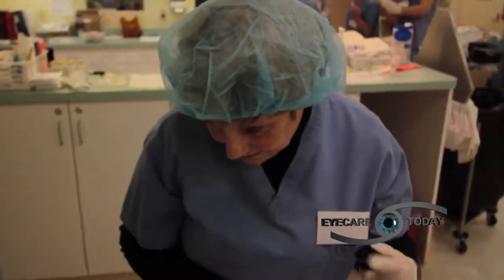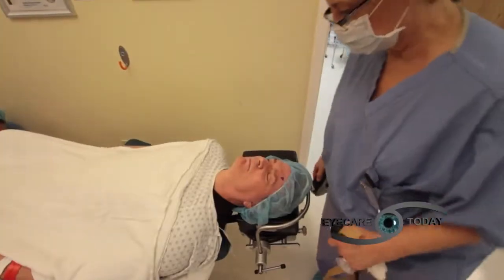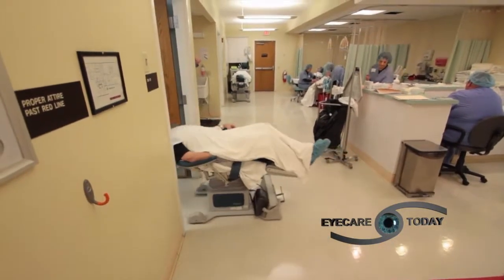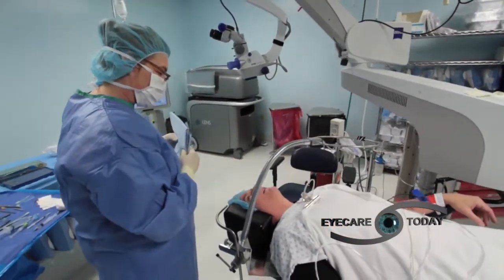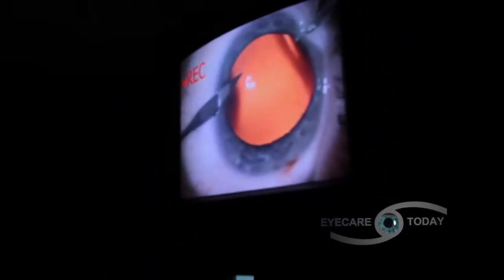I was prepped, point of no return now, and then waited for my turn to go into the operating room. Okay. You're next to go in. Okay. Once in the OR, some final prep work is done. Sure, my name is Denise. I'm Dr. Bucci's scrub nurse. So I'm going to start with a drape over your left eye and get you ready for Dr. Bucci. Okay? During cataract surgery, my pupil is dilated. It gives Dr. Bucci extra space to work with. It happens that the cataract is shaped exactly like a mini M&M.